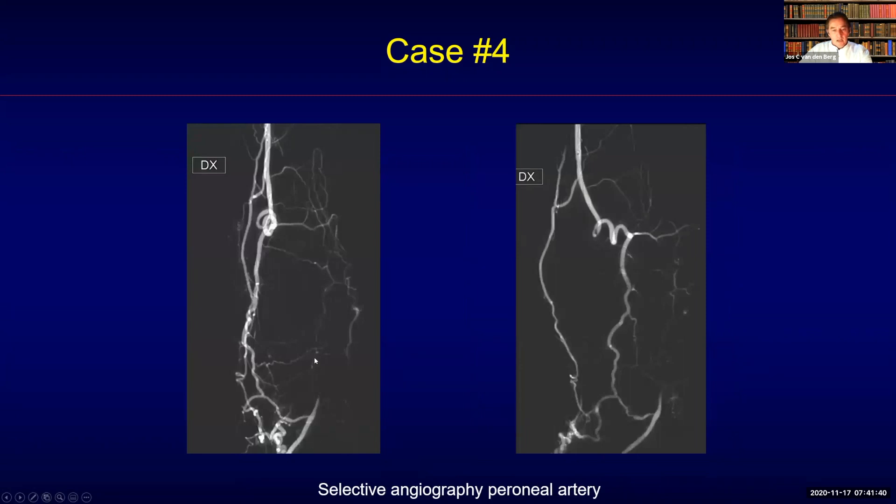A selective angiography of the peroneal artery was then performed, and here you can see in two projections a very large and good connection — although very tortuous — towards the posterior circulation. This was now my target.